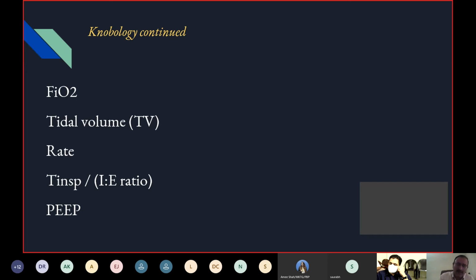But especially in an ARDS lung, the patients in whom you need a high PEEP are somebody who has a stiff lung. When it's a stiff lung, increasing PEEP does not actually alter the outer pressure of the lung, because the pressure stays internally, so it doesn't affect the blood pressure. If it's a normal patient, if the lung compliance is normal, then if you raise the PEEP too much, it might affect the blood pressure. But in a patient who has a tight chest, it doesn't matter.